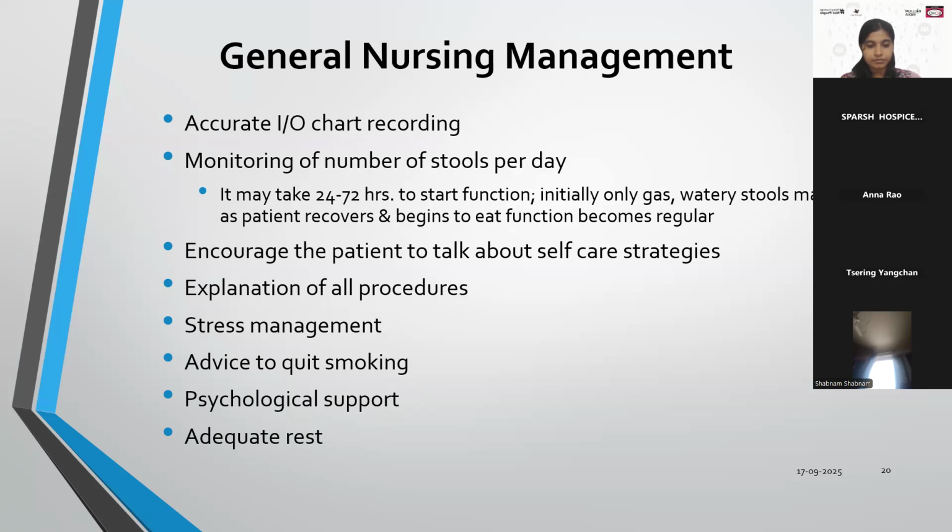Bleeding sometimes may be seen, especially at the time of cleaning or changing the pouch. At that time you may require to give slight pressure for 10 to 15 minutes, and even sucralfate powder can be applied. Find out whether any kind of herniation is there or not, and whether there is any kind of stoma prolapse.